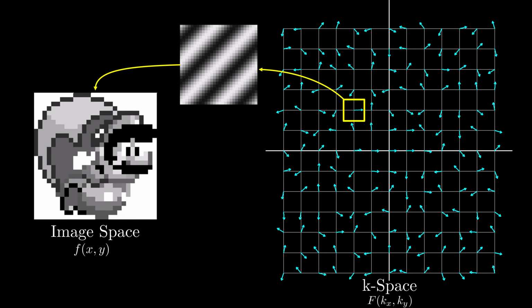The relationship between a discrete image and discrete K-space can be summarized by their own set of 3 rules. 1. The spacing between discrete K-space frequencies is inversely proportional to the image fields of view in X and Y, leading to a K-space grid separated by discrete steps of delta Kx and delta Ky. Note that X and Y fields of view are not necessarily equal, and thus the step sizes in K-space are not necessarily equal.